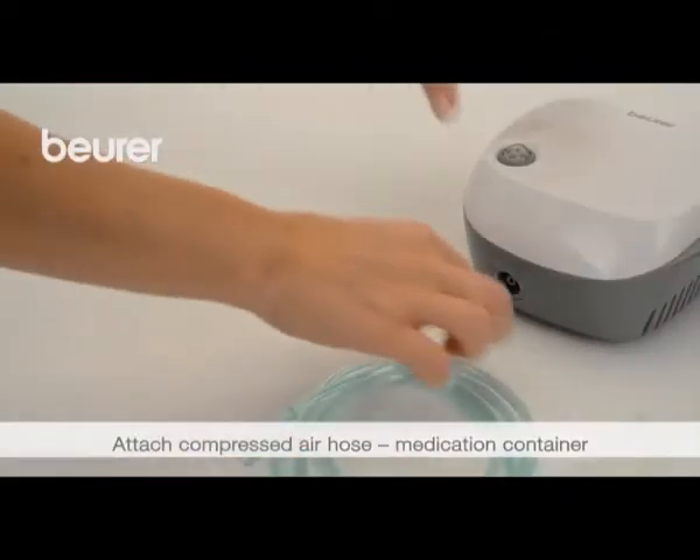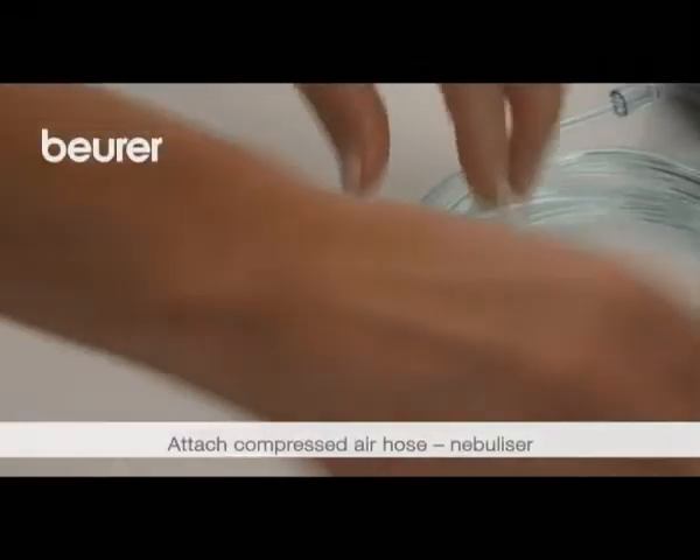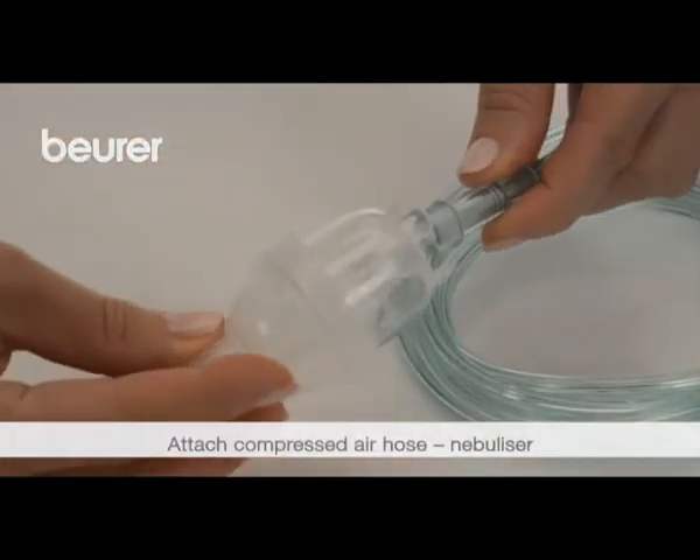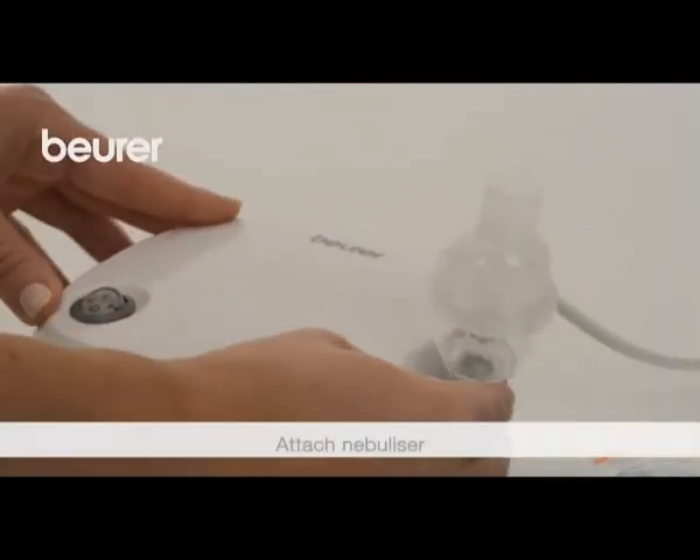Connect the compressed air hose to the medication container. Connect the other end to the nebulizer hose connection by turning it slightly. Connect the device to the mains.